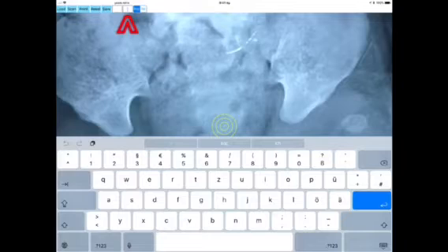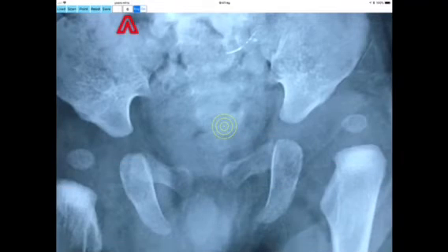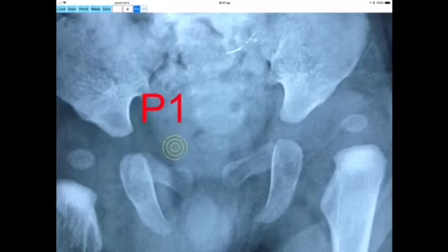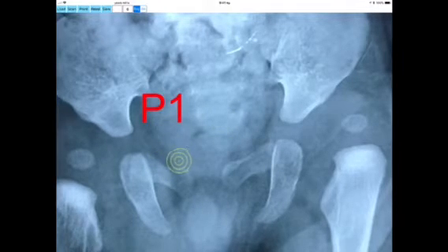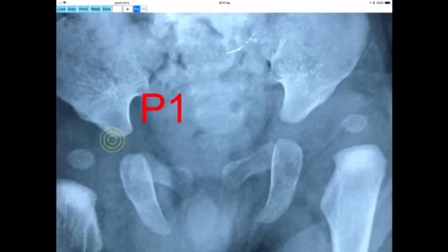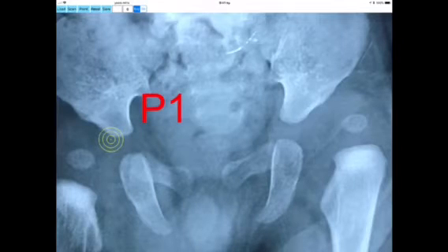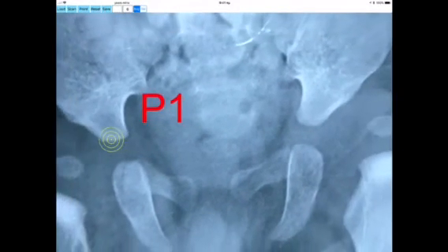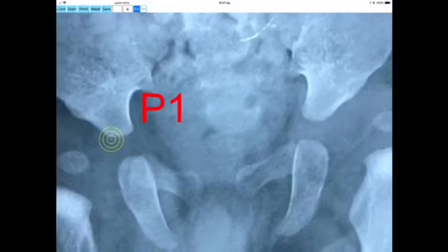Next you enter the age of the patient, which can be in years or months. Your aim is to locate the first point, P1, at the right hip by locating the juncture of the triradiate cartilage of the right hip. By pressing the point button, the first point P1 is marked.